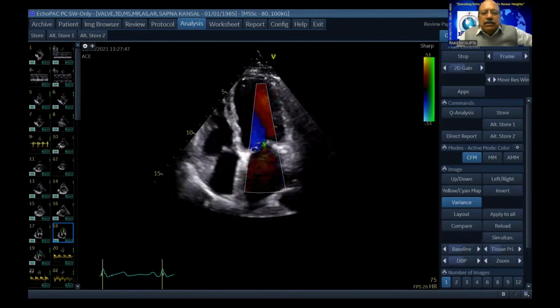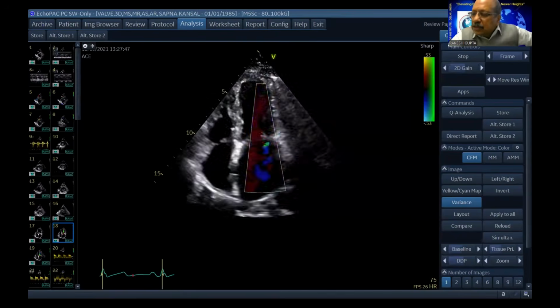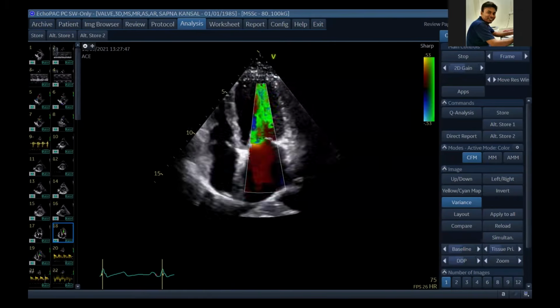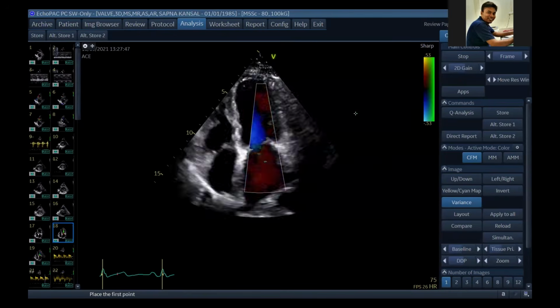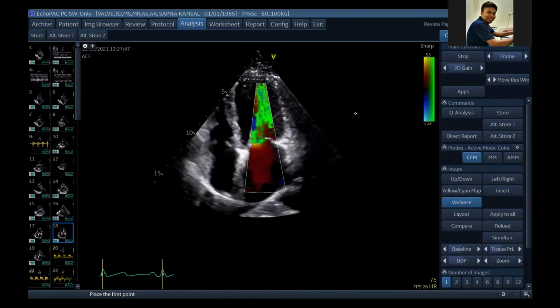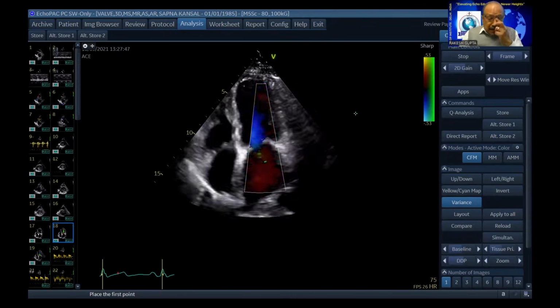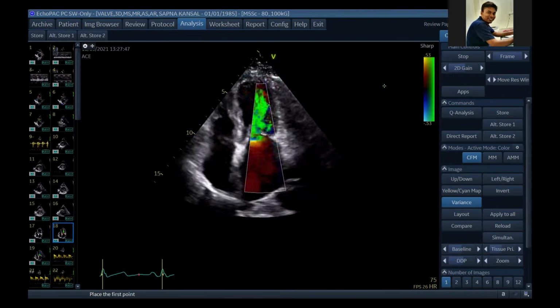All right. So let's go to Dr. Rajan Verma, row number 6. Rajan, go ahead. Good evening, sir. Good evening. Sir, I want to know how we will calculate vena contracta. Do we measure only the yellow part, or do we have to measure both the blue and the yellow part? Color between the two leaflets. Okay. Thank you, sir.